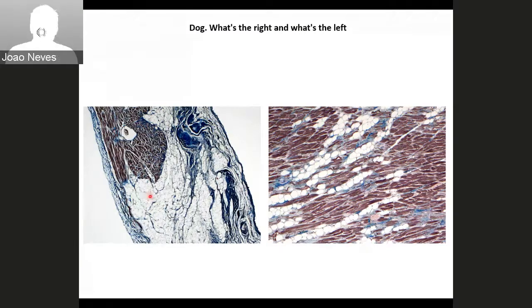Other question? Massimiliano, can I just ask a quick question, if you don't mind, about the right terms that we could use in an exam situation? Obviously, on the left picture, we have a transmural, and we can say that is a replacement, replacement fiber of fatty replacement that occurs transmurally. But on the right one, should we use interstitial, or should we say replacement?